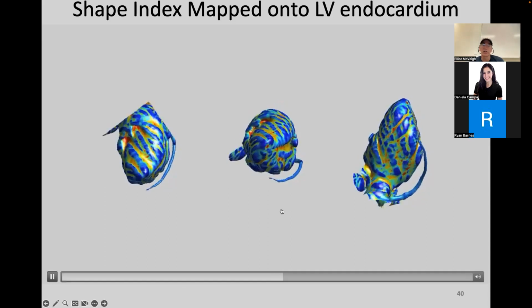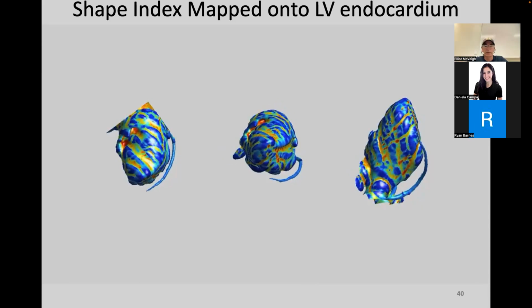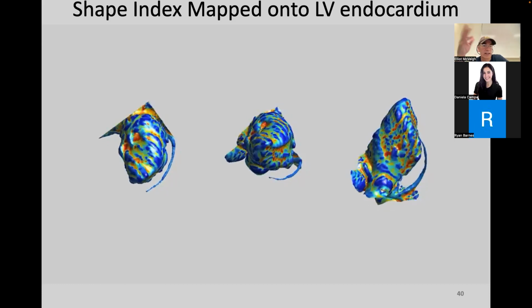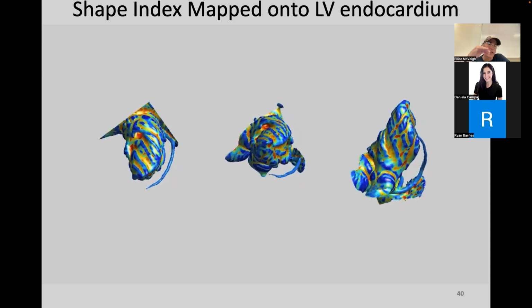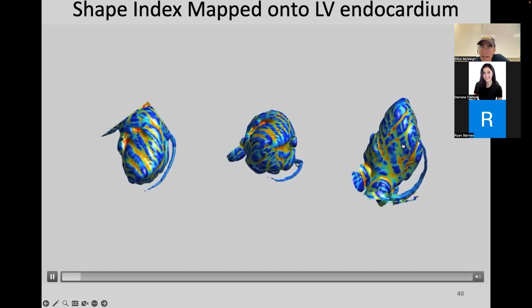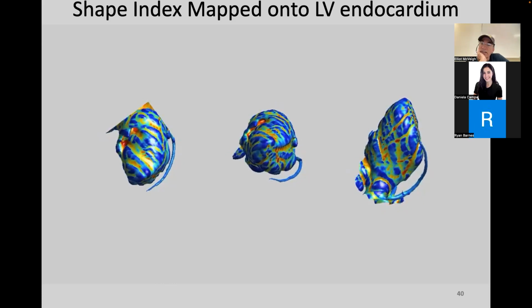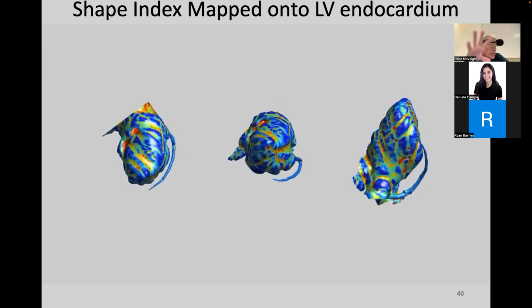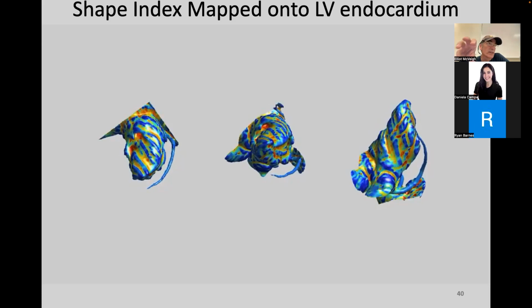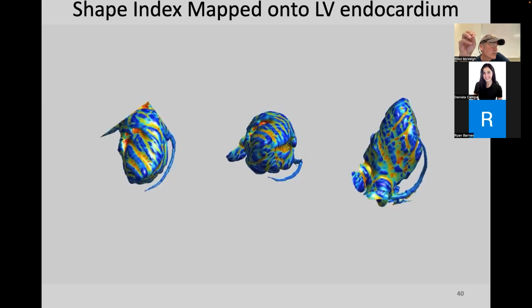What's color encoded here is the curvature of the function that we're displaying. If we consider this function a surface, and then we evaluate the curvature by the second derivative, where we have high, sharp peaks, we'll put a blue color, and so these are the high peaks. Where we have deep valleys, we'll put a red color. As you can see, those features are trackable. They move in space, and you can use those individual features as fiducial markers, in a sense, to track where that tissue is going, right?